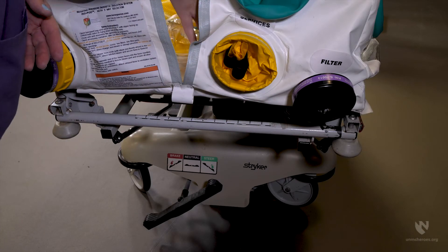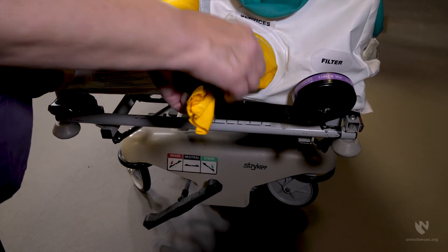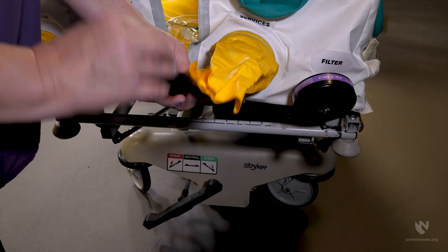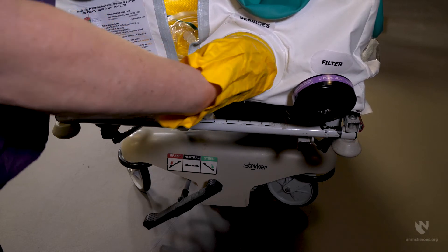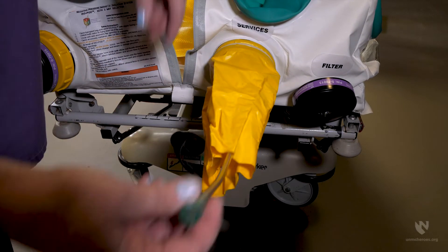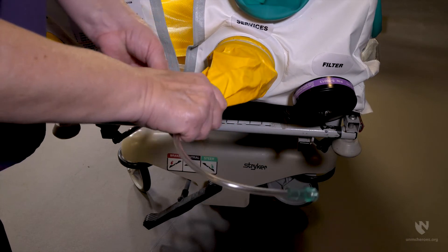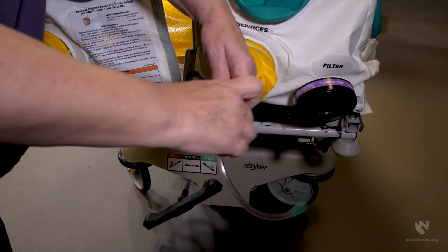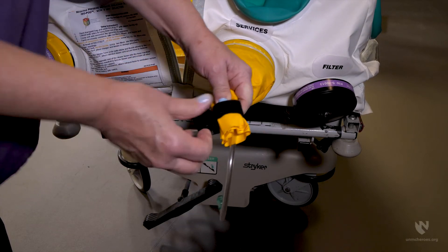Snorkel ports are used to manage lines and tubing necessary to support the patient. Oxygen tubing, IV lines, ventilator tubing, etc. should be placed into the enclosure before the patient is loaded and fed through the snorkel port to the exterior. The hook and loop straps should then be wrapped tightly around the snorkel port to secure the lines in place. You should consider adding tape around the lines to further secure them.